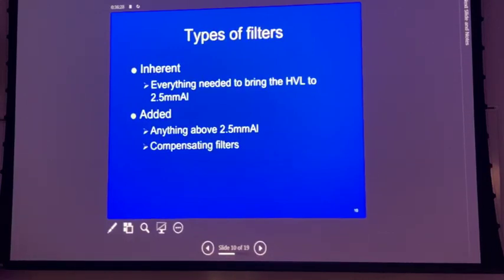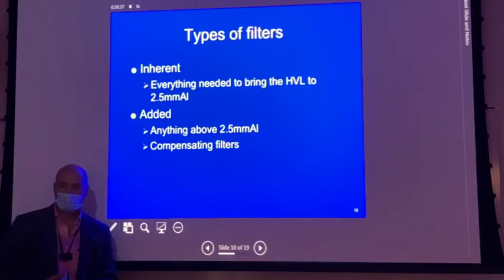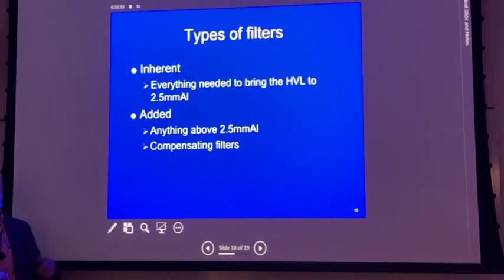The ability to image on CR and DR, with the computer algorithm evening out contrast and density differences in tissue, has kind of taken the place of compensating filters. Anybody seen a wedge filter in clinicals? Mm-hmm. Have you? Oh, really? I'm sorry, no. What's up? It'd be great if you had, because I think they're still relevant.